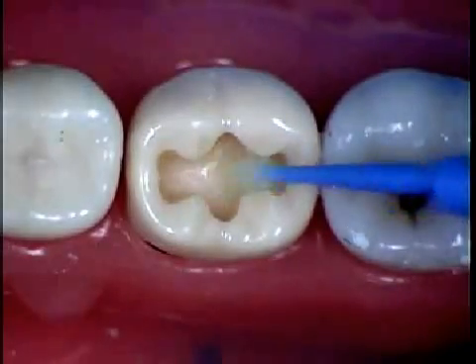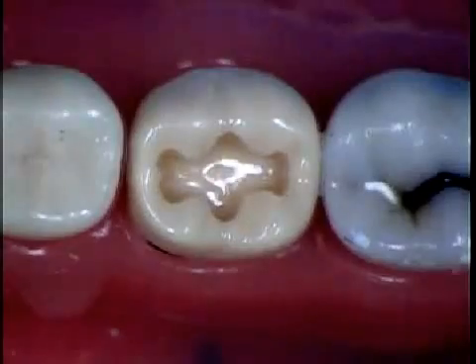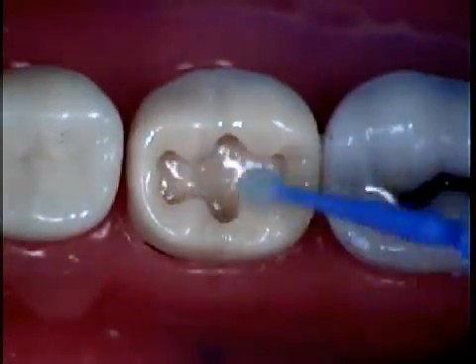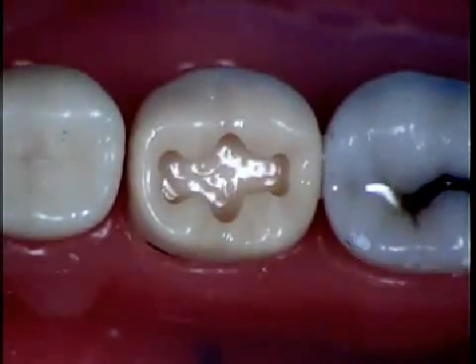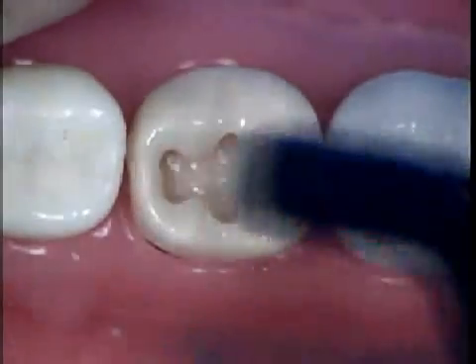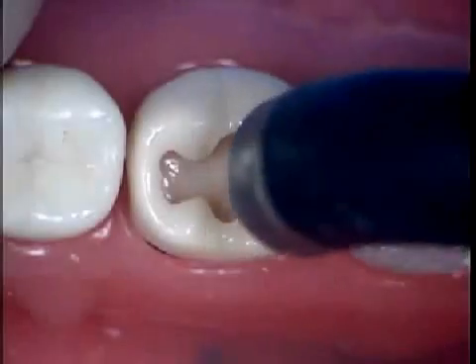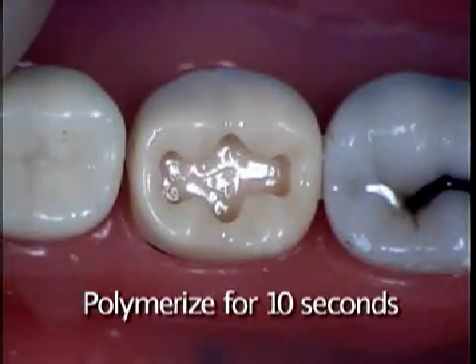If you've applied too much bonding agent, air blow and remove all the excess away. You can also get a dry applicator and just remove the excess. Evaporate the solvent with the air. Then you are going to light cure for 10 seconds. Do not look at the light while you are doing the polymerization.